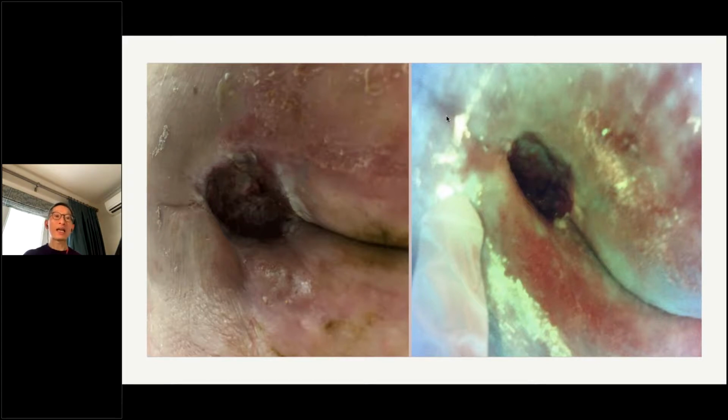So that indicates that if we're not creating the seal, the bacteria, either from urine or from the fecal material, continue to colonize on the skin. And it's great that we're able to protect the wound from this contamination. Otherwise, there would be increased risk for local infection problems.